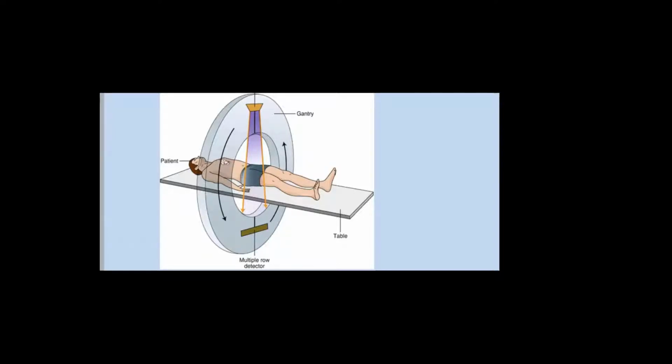A question for you all. Any imaging technology, the diagnostic accuracy of which depends on resolutions. What types of resolution do you know? Spatial resolution. Very good. Temporal resolution. Very good. These are the two most important. The spatial resolution is the ability to differentiate between two close dots, for example.